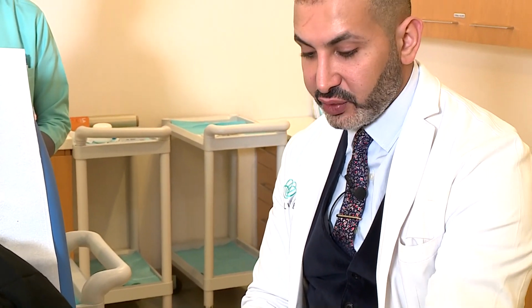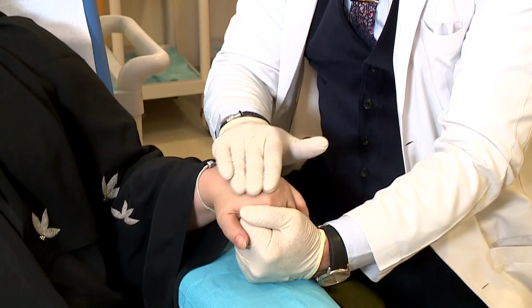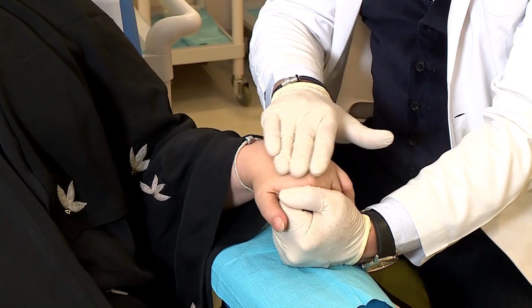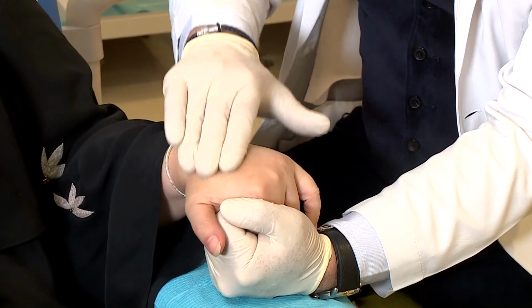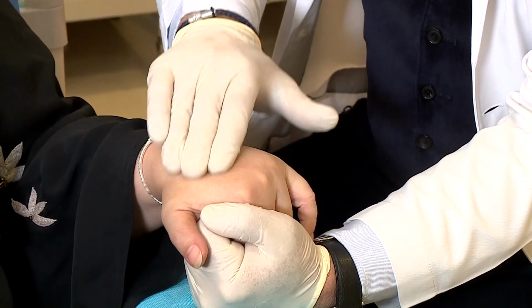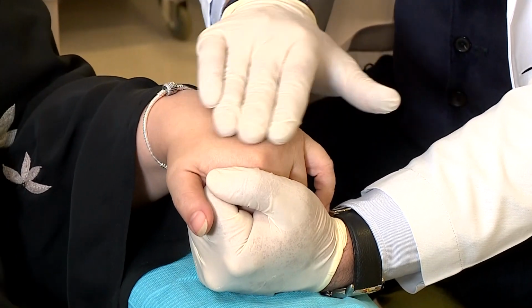It will make it much easier to massage. You can start with the other hand and then come back to the hand that you injected first. So the product, once it takes the body temperature, you can massage it easily and it will show good results. The instructions that we usually give the patient is frequent massaging in the first 3 days in a circular way on the dorsum of the hands, 3 to 4 times a day, each time around 5 minutes. Gentle massaging will help to distribute the product more.